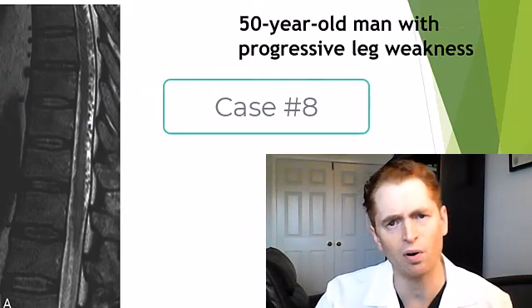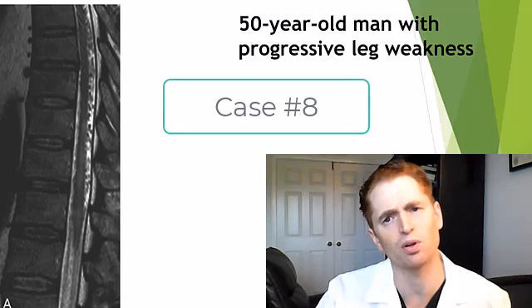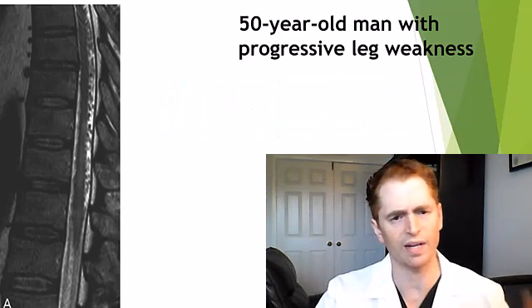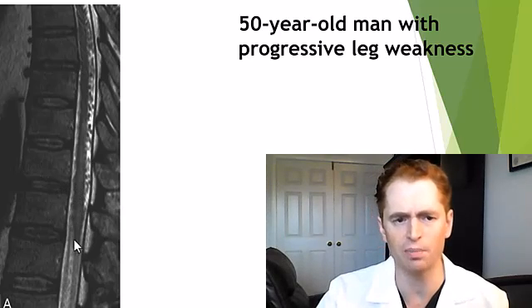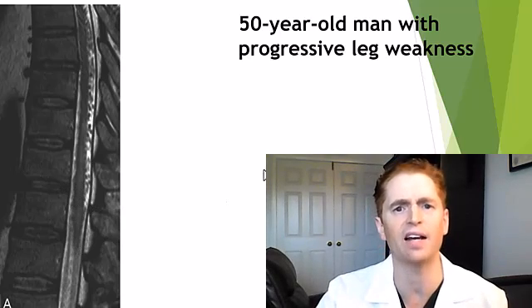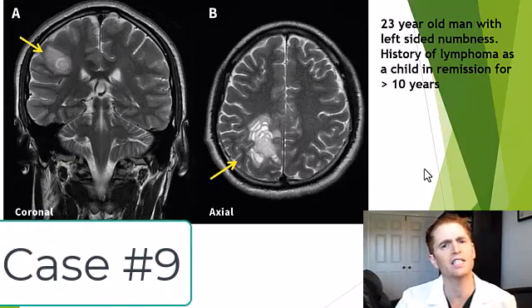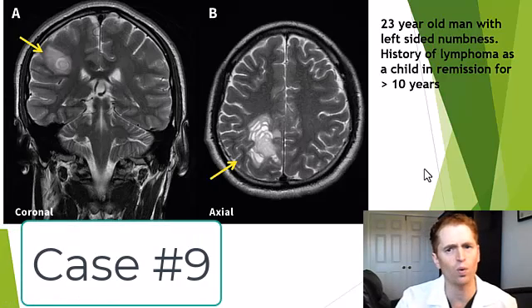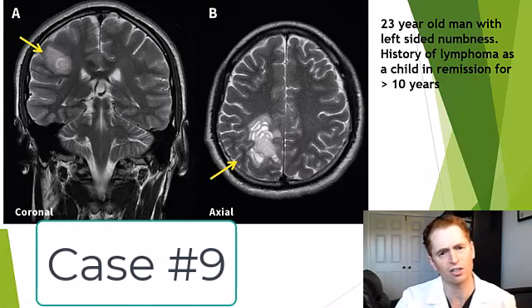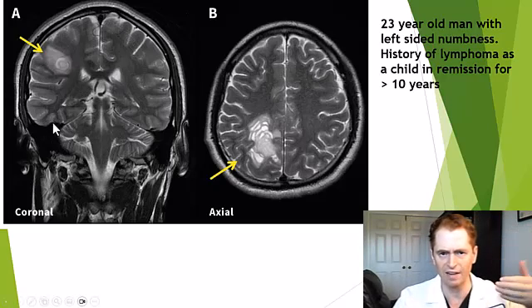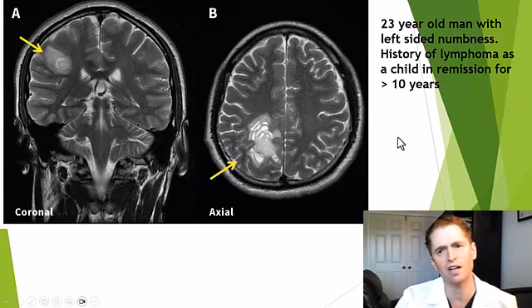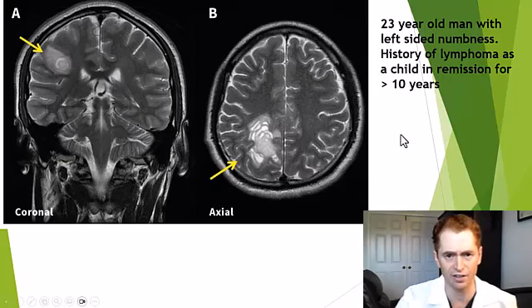Here is a spine MRI of a 50-year-old man with progressive leg weakness. We're looking at sagittal images through the spine. Just to orient you, this is the conus medullaris, the end of the spinal cord. Next is a 23-year-old man with left-sided numbness. These are T2 sequences — a coronal view on the left and an axial view on the right. Of note, he has a history of lymphoma as a child, but in remission for more than 10 years.